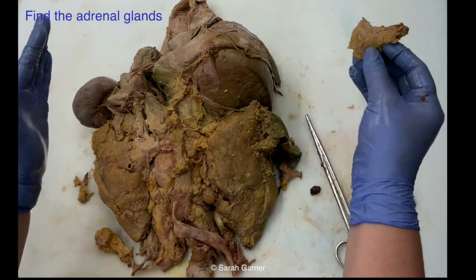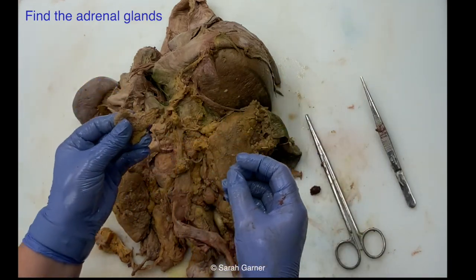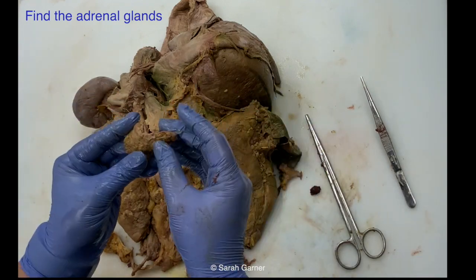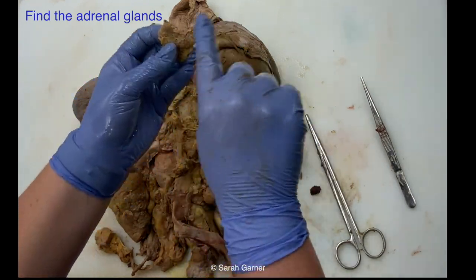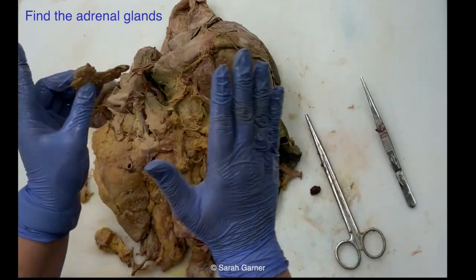Other people do different things. Just whatever you're doing, make sure you know what you're doing and keep it consistent so you don't ever confuse your sides. And let's say there's a lot of people in the autopsy, let's say it's a good teaching case, just put it on a paper towel and write R on the paper towel. That way, if somebody moves it or if multiple people are dissecting it, you just know what's going on, right?